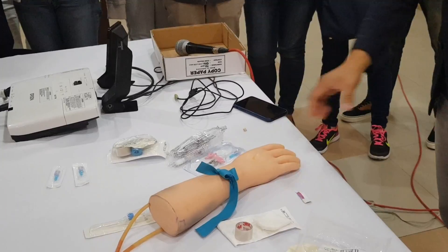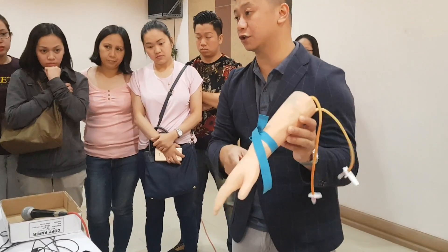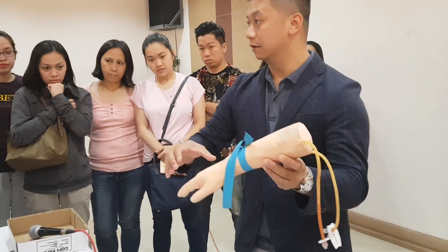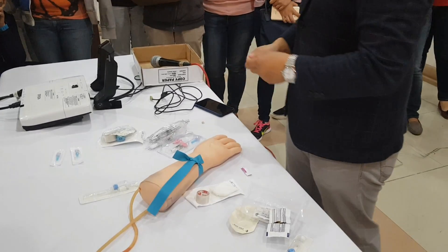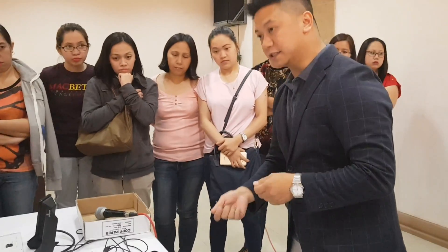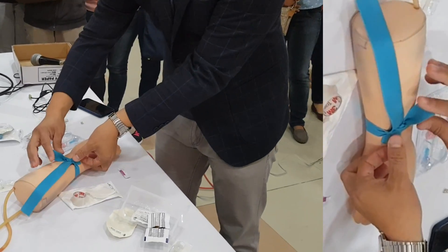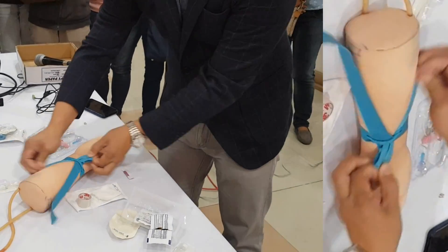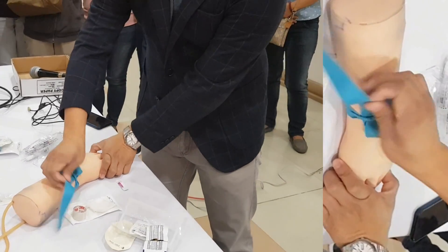Even if it flaps around, it won't touch your insertion point. To tighten your tourniquet, just pull the shorter side in the loop — it will tighten it. If you want to release your tourniquet, just pull the longer side.